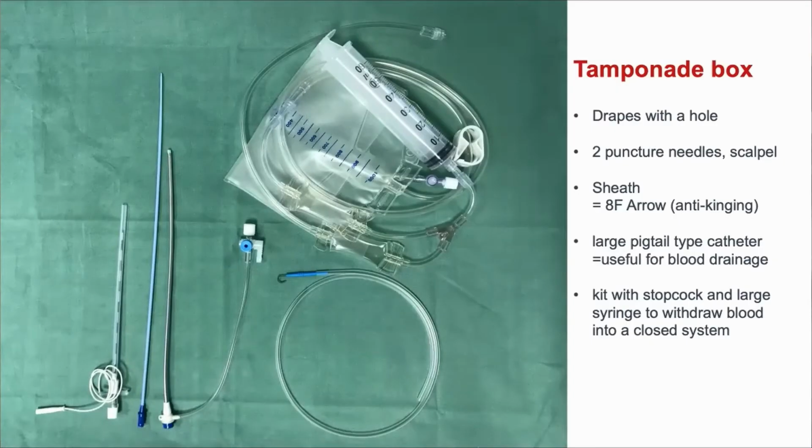Perforation of the heart wall with subsequent tamponade is the most common cause of death in connection with catheter ablation. Acute cardiac tamponade is a very dramatic situation that requires immediate intervention in the form of pericardial puncture, aspiration of pericardial content, and introduction of a drain into the pericardial sac.